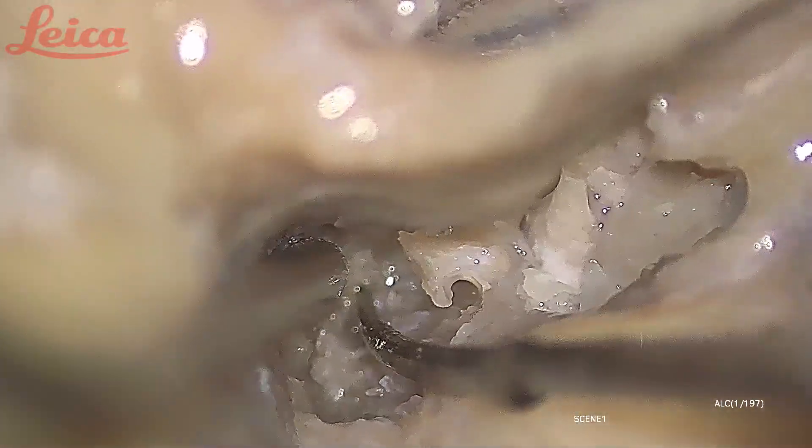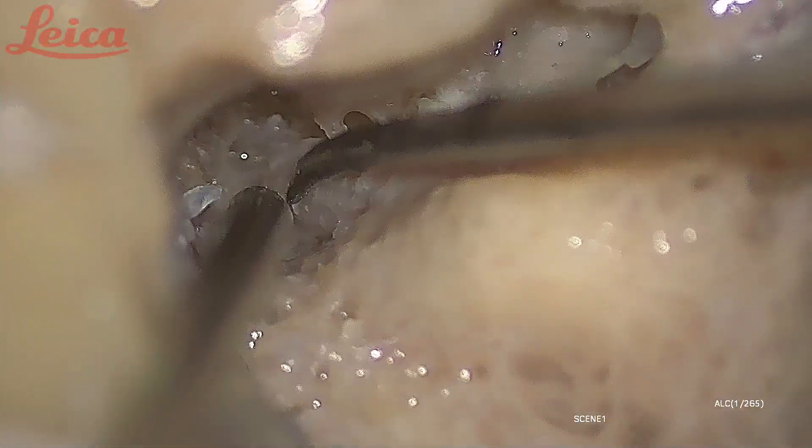If you look here, it looks like the facial nerve is going in this direction, but actually the nerve is taking a turn here. What you are seeing here is the greater superficial petrosal nerve — this is the GSPN which I am hooking with my instrument. This is the first genu. If I lift the nerve, you can see the nerve is taking a turn — this is the beginning of the labyrinthine segment. This bend is the first genu; whatever is going deeper is the labyrinthine segment. This is the geniculate ganglion, and this whole structure is the GSPN. You can almost see a canal — that is the canal for the GSPN.